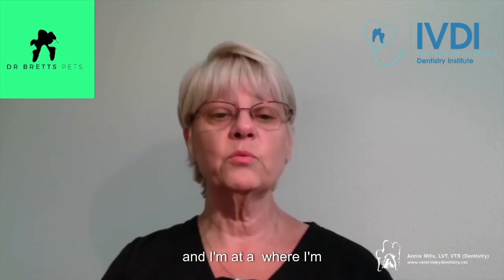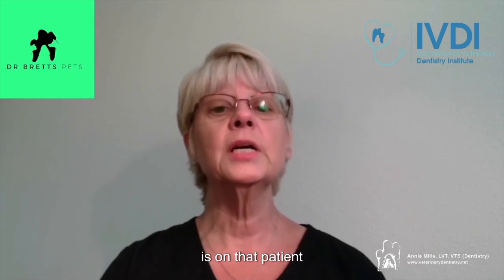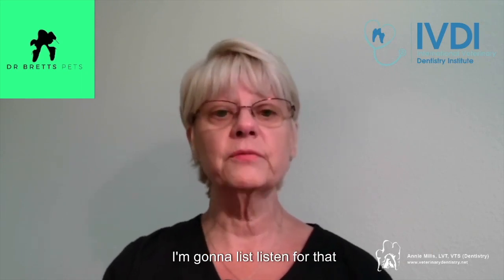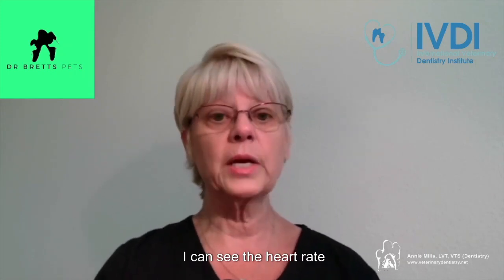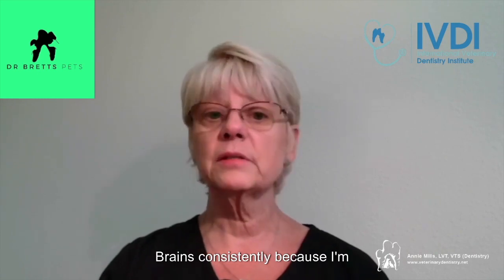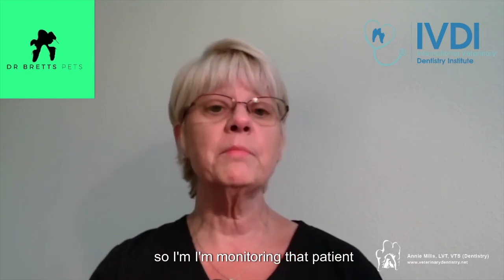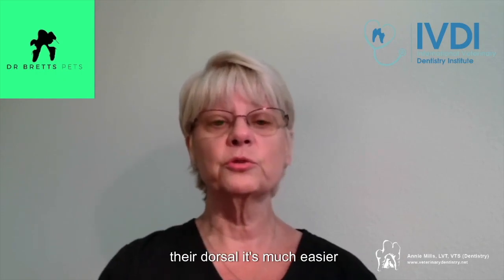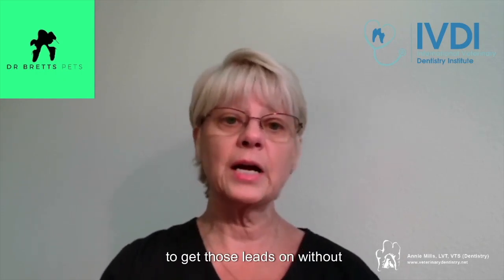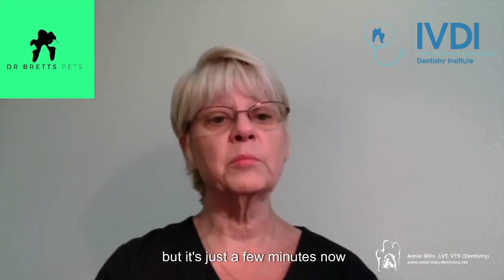And I'm at a point where I'm comfortable enough that I'm not overthinking x-rays. I can do those in my sleep. And the majority of my attention is on that patient. I'm going to listen for that Breathe Safe to beep, so I know he's breathing. With the pulse ox, I can see the heart rate. I'm looking at the mucous membranes consistently because I'm in the mouth. So all of those parameters, I'm monitoring that patient from the outset. And then once they're dorsal, it's much easier to get those leads on without twisting and tangling them up. And then we move on from there. But it's just a few minutes.